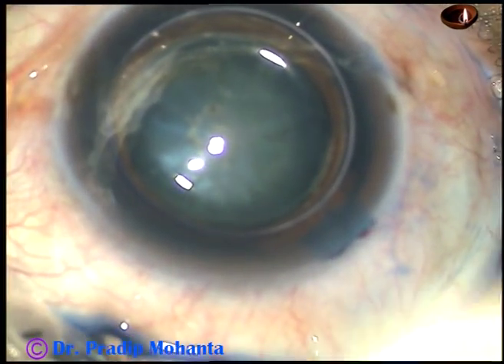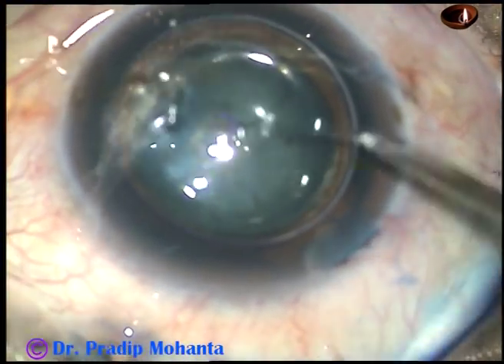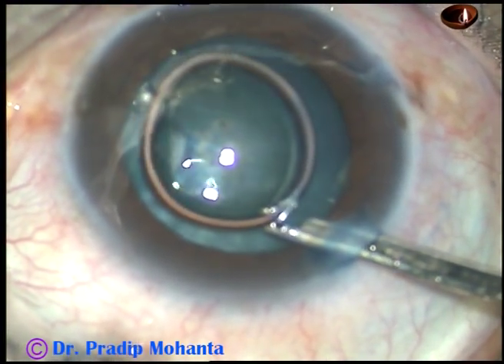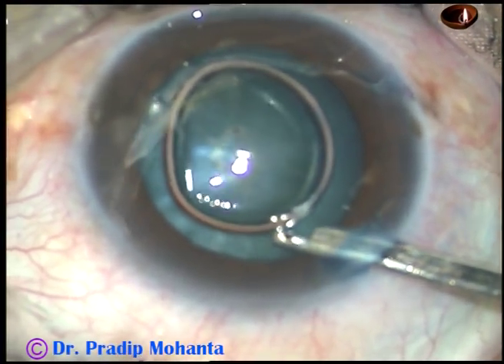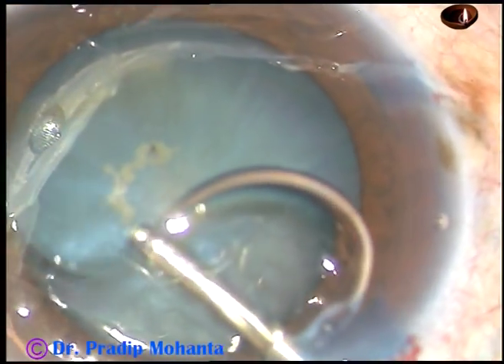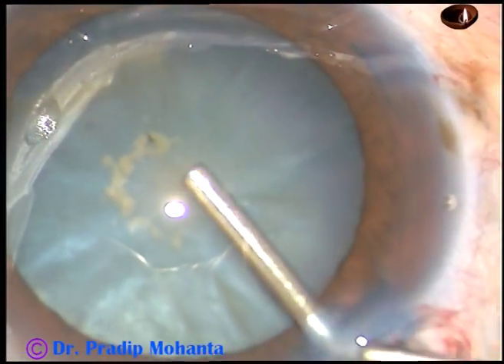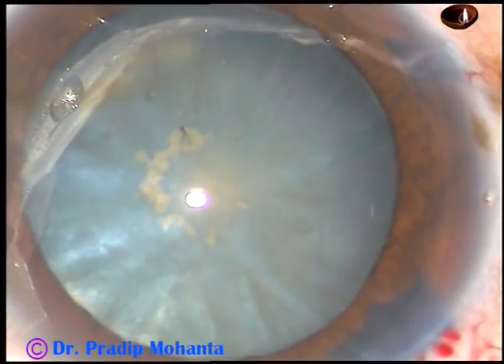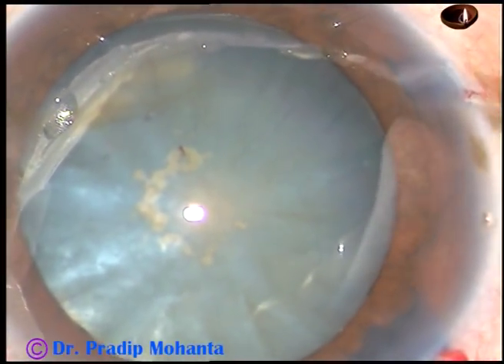This is a bit of adrenaline. Now the dye is washed out. The anterior chamber is filled with HPMC, and now is the time to do capsulorhexis.